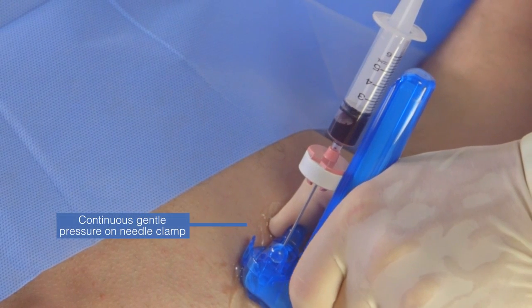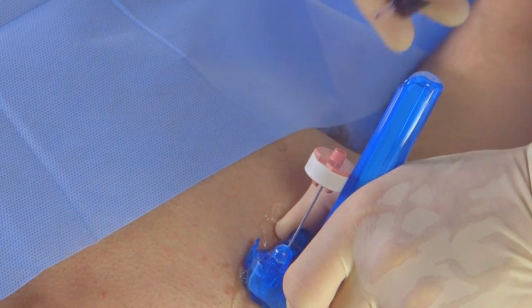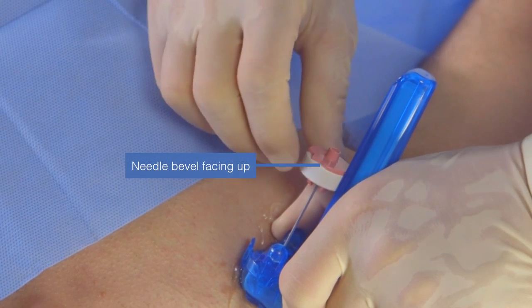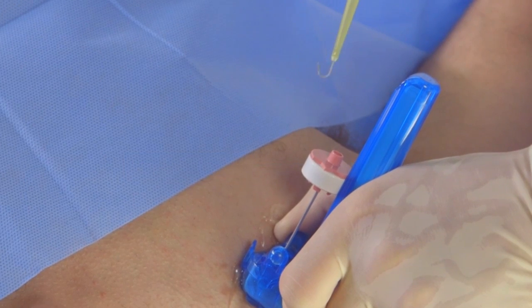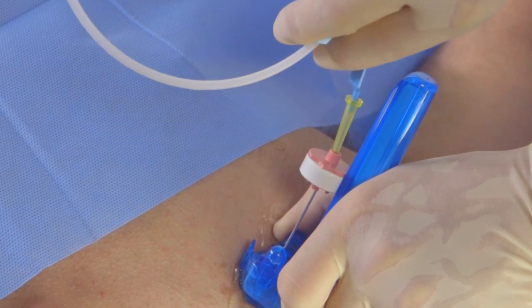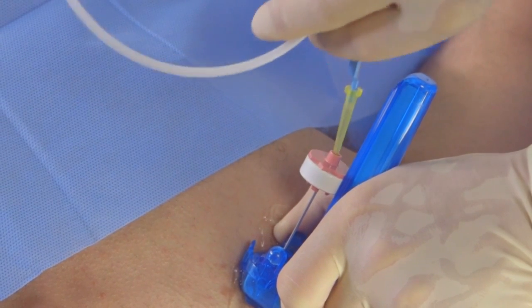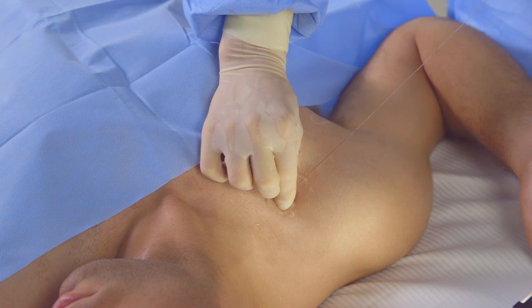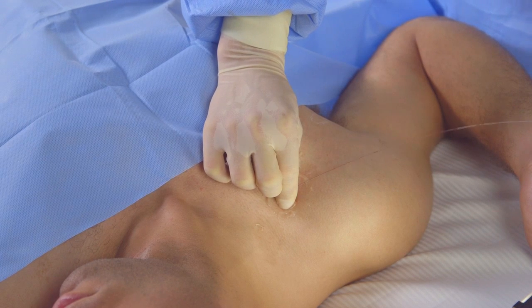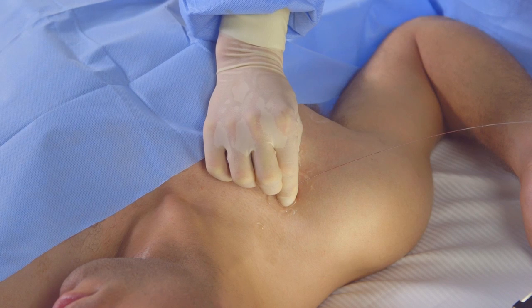While holding pressure on the needle clamp, pop the syringe off the needle by pinching the space between the syringe and the needle hub. Check that the needle bevel is facing up and with the open side of the J of the guide wire also facing up, advance the guide wire. The guide wire entering the vein can often be observed in real time on the sonogram. While maintaining gentle pressure on the needle clamp, withdraw the probe and needle over the guide wire, gripping the guide wire between the thumb and first or second finger once the needle tip clears the skin surface. Continue with the Seldinger technique.